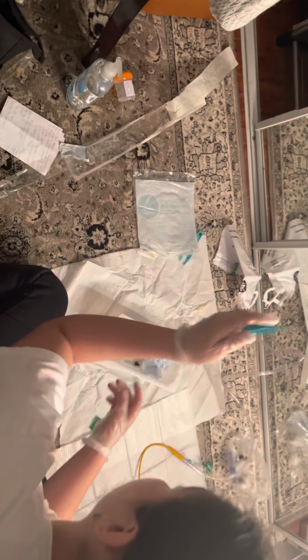Placing it in here. This goes into the sharps containers. So let's say I put it into the sharps containers.